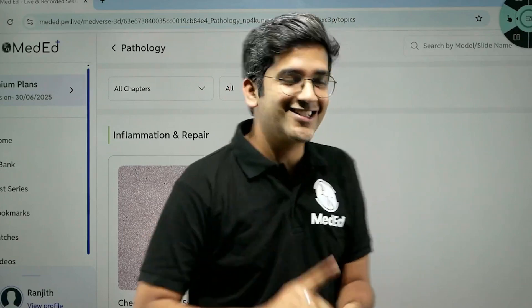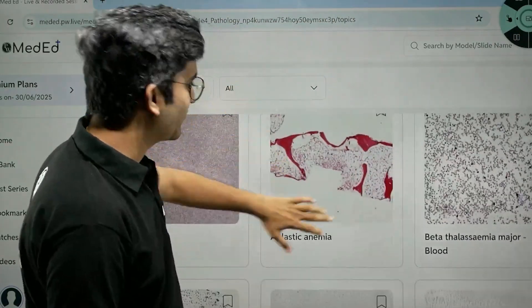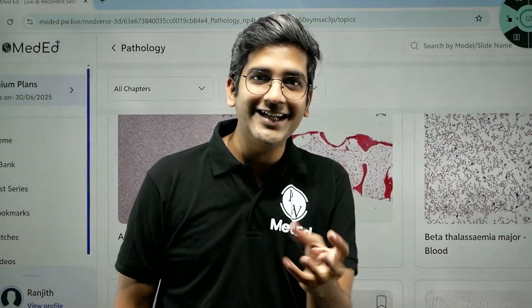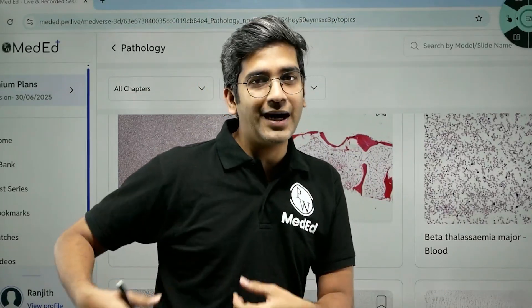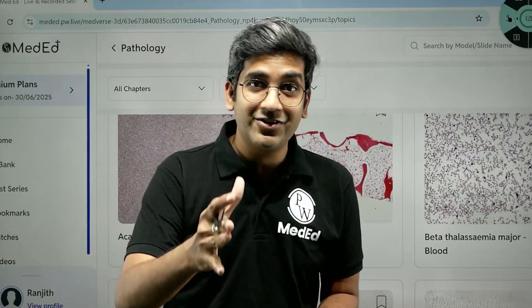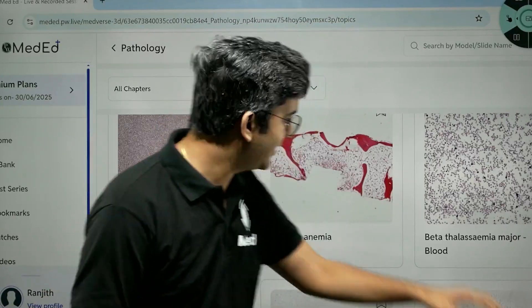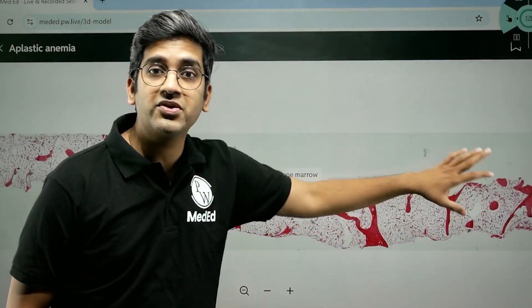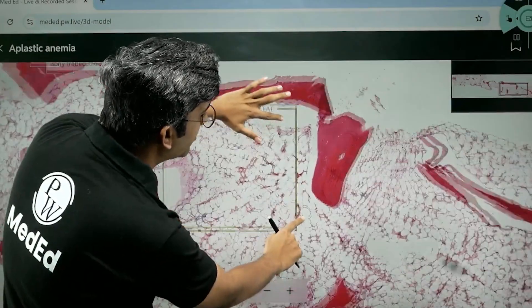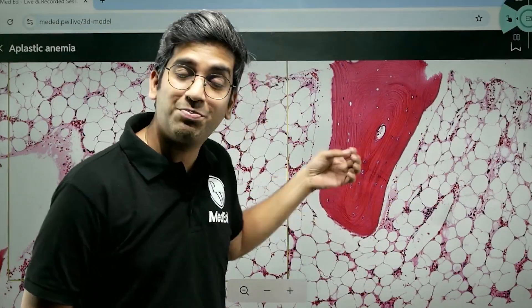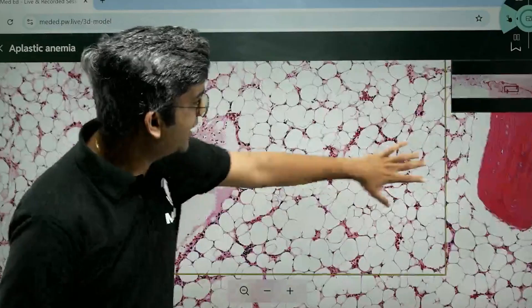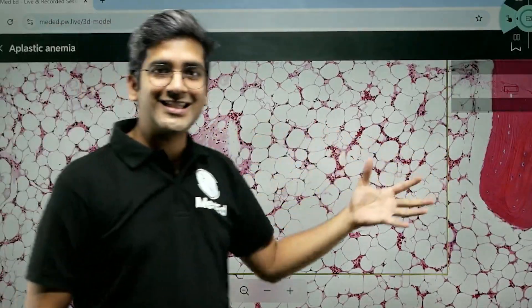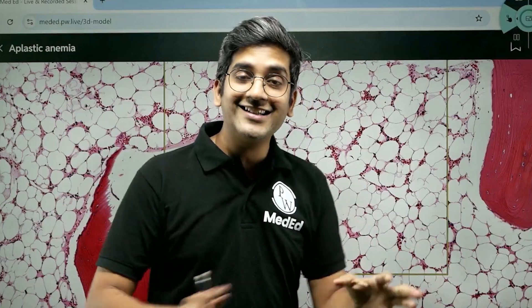Let's explore and see if it's really useful or just gimmicks. If you click on aplastic anemia — everyone knows it's an anemia where the bone marrow fails, with dry tap, and under the microscope fat replaces the bone marrow space. Click on the slide of aplastic anemia. This is a perfect bone marrow biopsy of an aplastic anemia. If we zoom in, you can zoom just like a normal microscope. You can see the bone with its lamellations, the trabecula, and the bone marrow space. The entire bone marrow space is clear — filled with fat — which helps in diagnosing aplastic anemia.